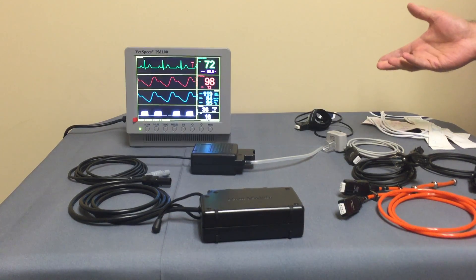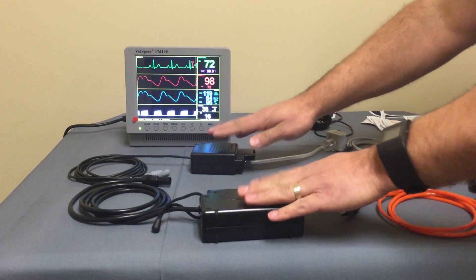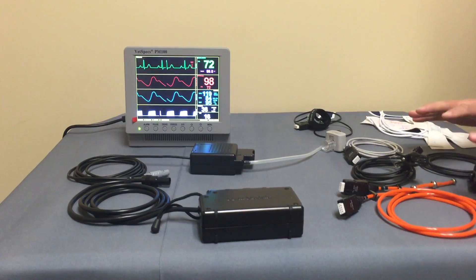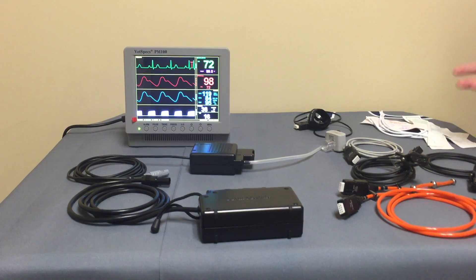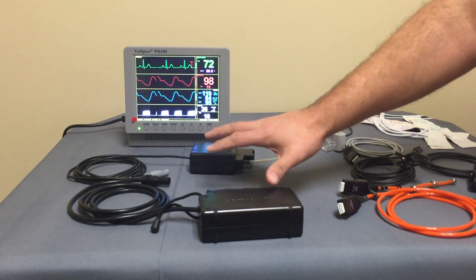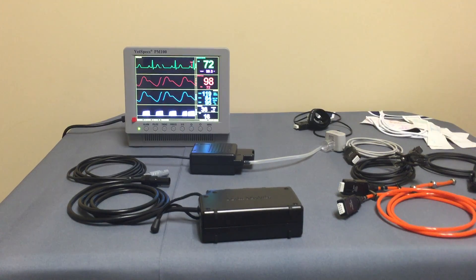You have the main monitor, the multi-parameter module, the blood pressure module, and all of the sensors and probes that attach to the modules and to the patient. Essentially a three-part process: the monitor as the power source, the modules for processing the data, and the sensors and probes which detect the signals as they attach to the patient.